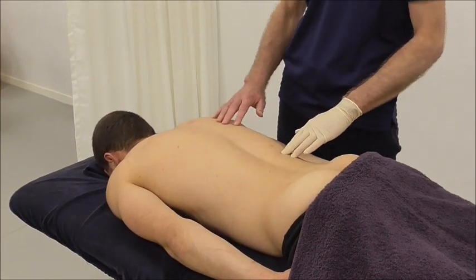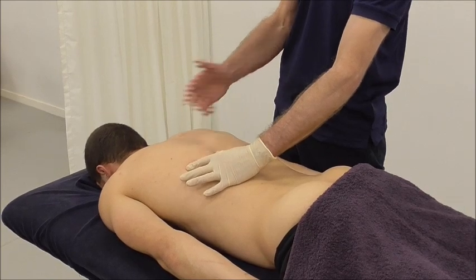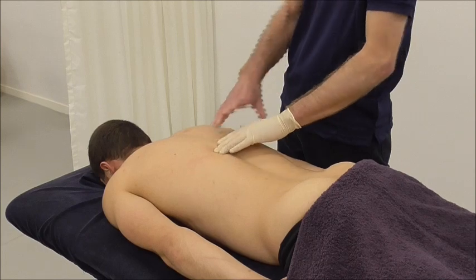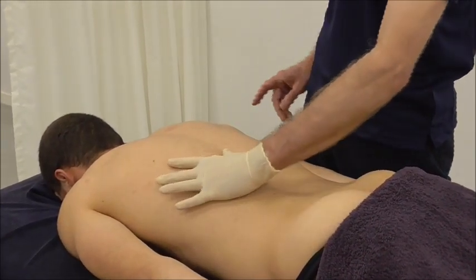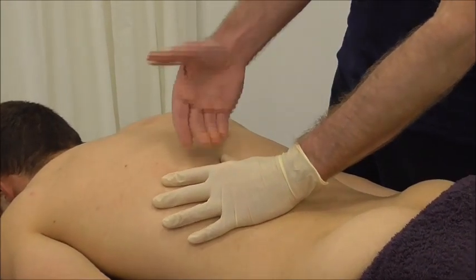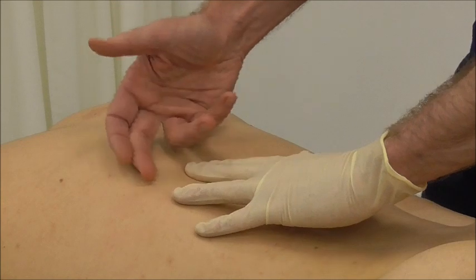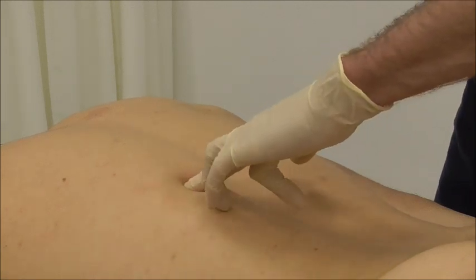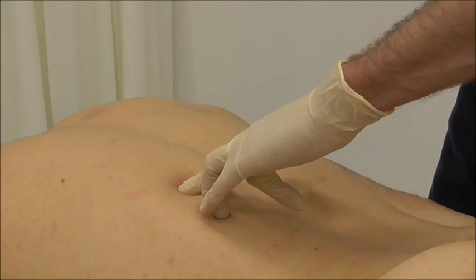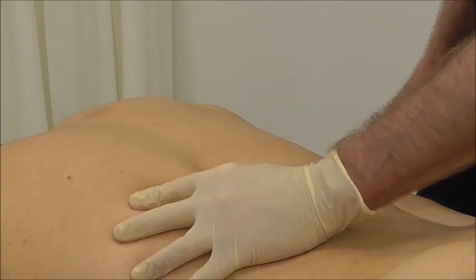With good muscle tone, there is a thicker muscle here so the depth would be greater. However, if I press the muscle down, I'm actually closer to the pleura and the lung. So the technique I use is a muscle fold, drawing the muscle upwards. If the pleura is one centimetre deep and there is one centimetre of muscle on top, that gives a total safety margin of two centimetres. Using a smaller needle or taking a muscle fold and drawing it upwards can increase that safety margin.